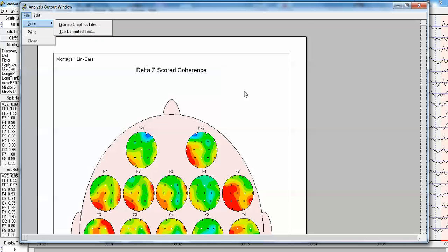So in any case, this is the phase slope index, and it is an add-on to NeuroGuide. In the future, there will be a LORETA phase slope index, or effective connectivity, where we'll be looking at the magnitude and direction of information flow between all combinations of 88 Brodmann areas in networks of the brain. We'll be able to see that in the raw scores, as well as the comparisons to age-matched normals with Z scores.